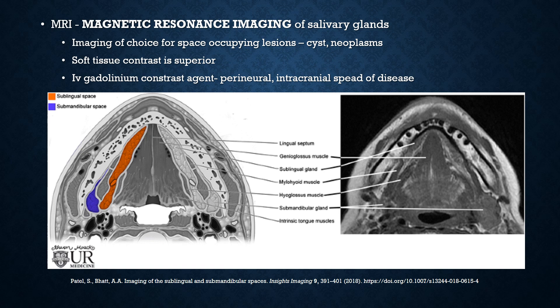Magnetic resonance imaging of salivary glands is the image of choice for space-occupying lesions such as cysts and neoplasia. The soft tissue contrast is superior, and intravenous gadolinium contrast agents are injected intravenously so that perineural and intracranial spread of disease can be observed more clearly. The images here show the normal appearance of the sublingual and submandibular spaces and glands on MRI, bilaterally.